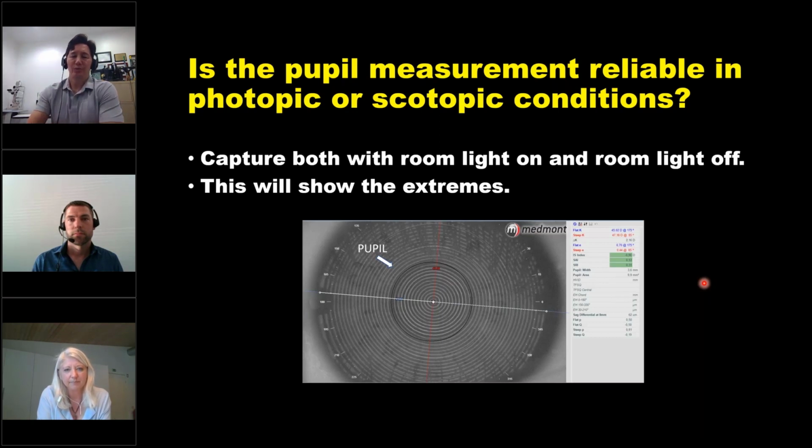Meta, how do you use Medmont's pupil diameter? How is this used in your practice? What I use it for is doing multifocal lenses, to find out how large a zone size I want. Also, when I'm designing lenses, how large or small can I make the back optic zone diameter to avoid that the lens will create some aberrations in the visual field.